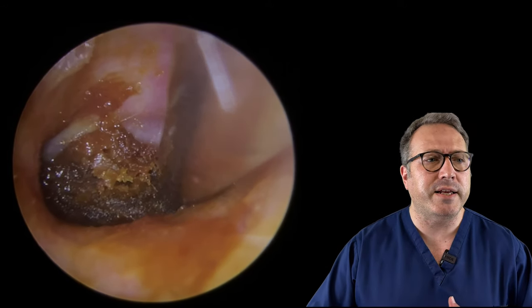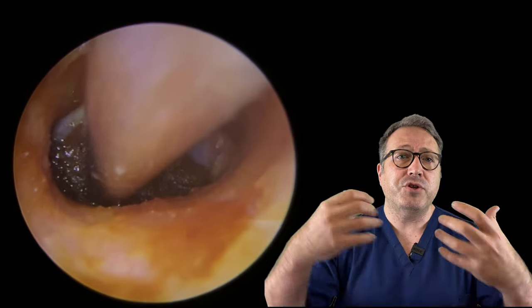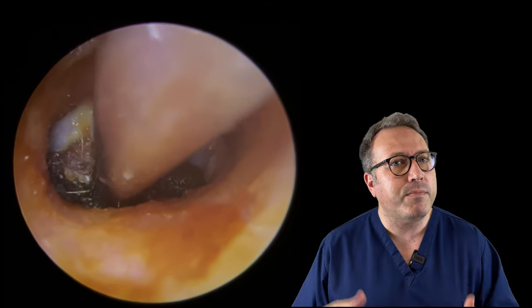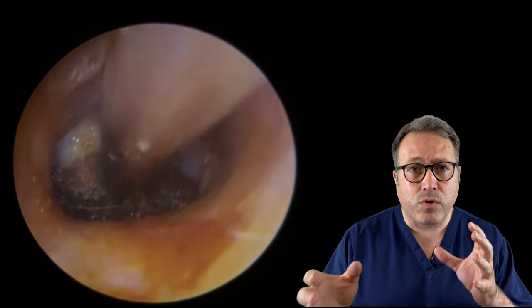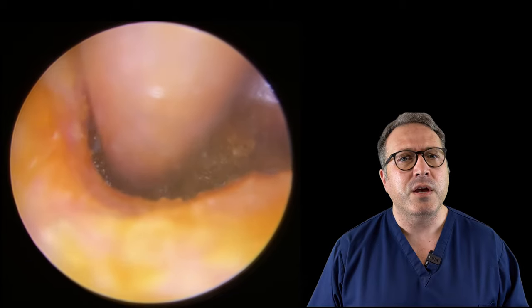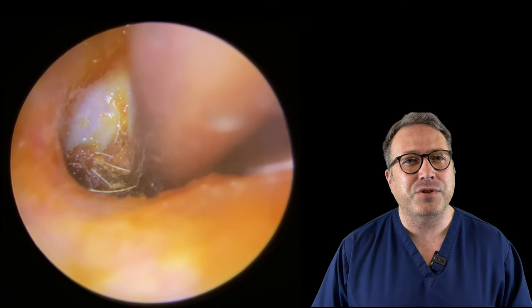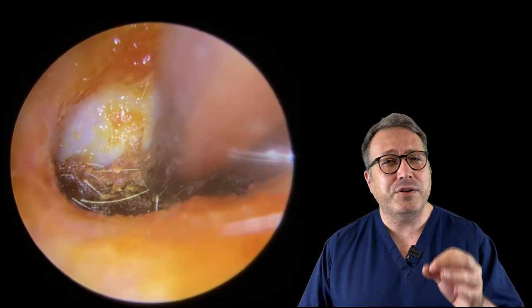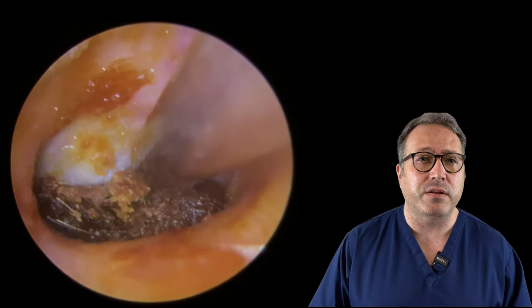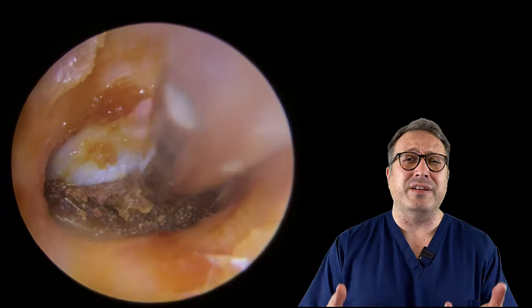It can be a little bit uncomfortable - this is a really sensitive part of the ear. So we're always checking in with our patients during these types of suctions, just to make sure they're not experiencing any dizziness. That can happen when suctioning deeper in the canal - you're drawing outside air deep into the canal through the suction, which is constantly dropping the temperature in the ear canal. If that happens, we say to the patient to let us know, we take a break for a couple of minutes, allow the temperature to equalize, and then carry on. You've always got to remember - you've got a person sitting in front of you, and that person's comfort and safety is the priority.